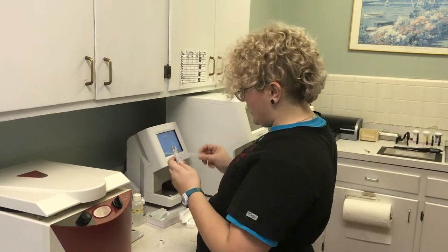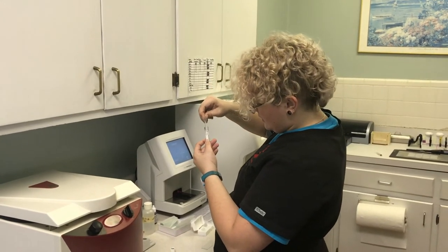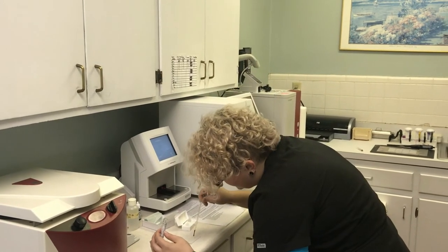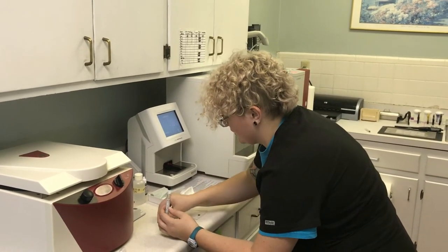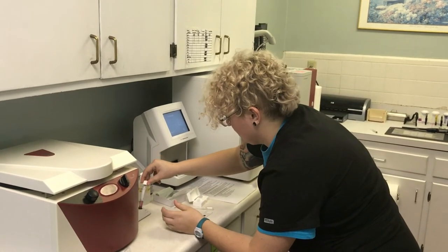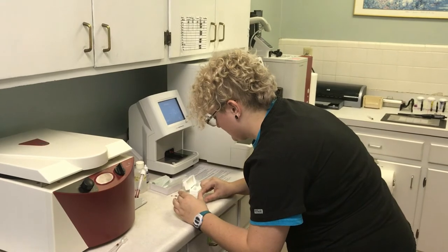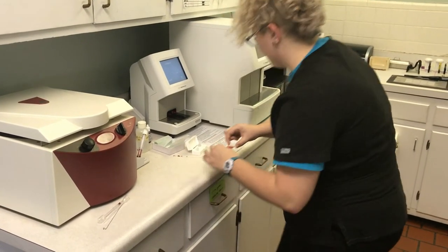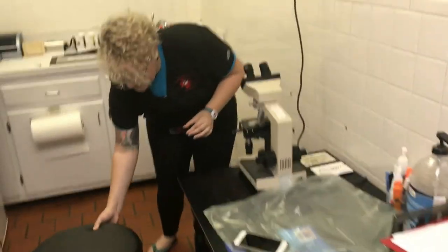Using a new dropper, I'm going to go ahead and take out one drop and place it on my slide. Next I'm going to go ahead and put a coverslip on it.